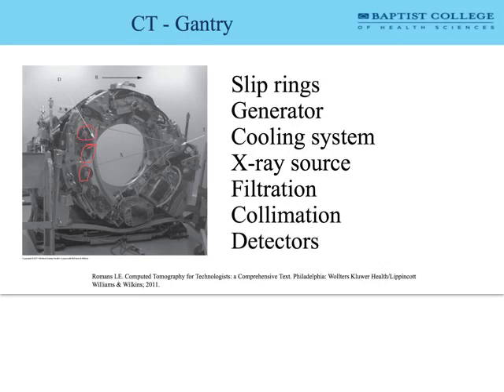They determine the life of the tube. They determine how quickly the imaging can occur. They determine what kinds of energy ranges you can work with. So if you're ever in a management position and you're tasked with acquiring a CT scanner, know that the anode heat unit rating is really, really important.